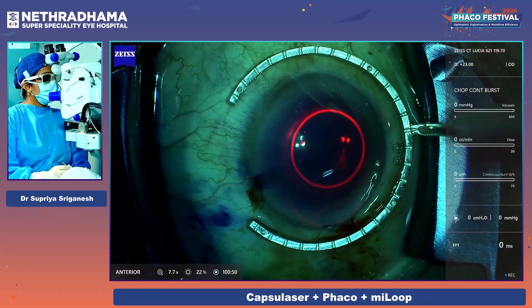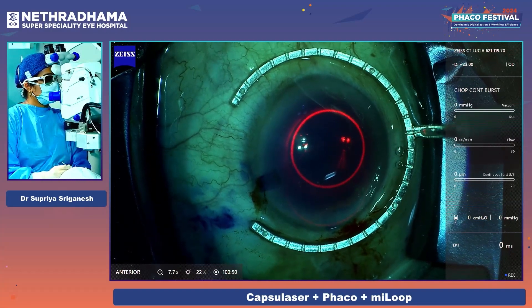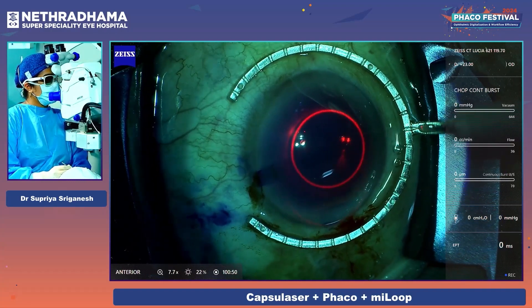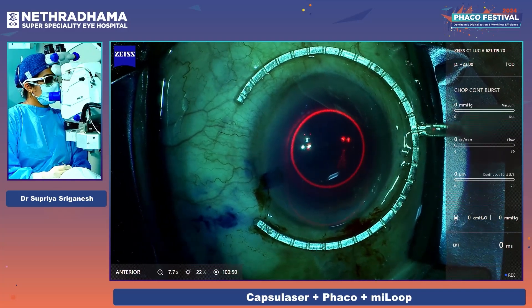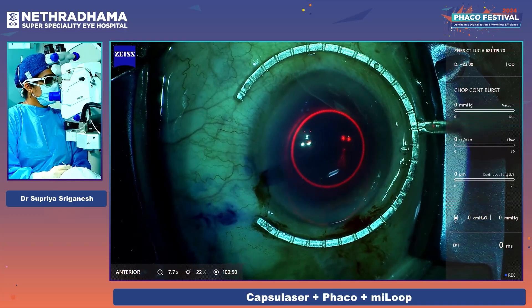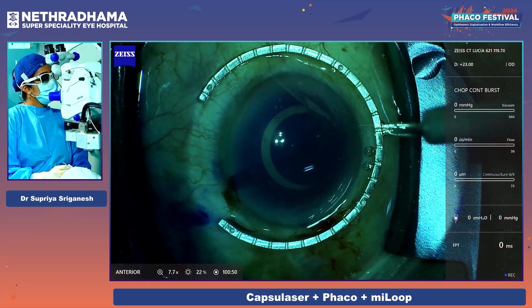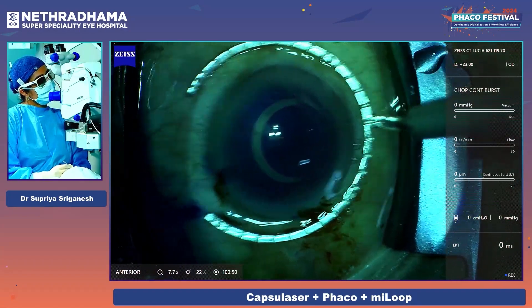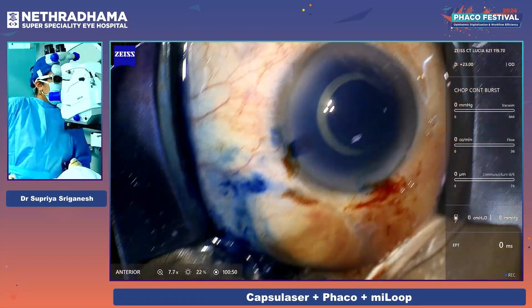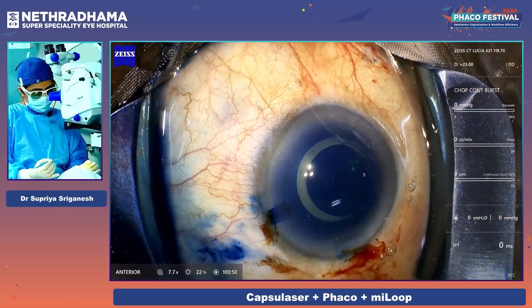Yes — two of the red dots are on the cornea, two of them are on the capsule. It's important to focus on the dots on the capsule. It just takes about one third of a second for this laser to fire — just observe. I'm stabilizing the eye now. You can see that the laser is fired. It's a little bit uneven there — I'm just going to use a forceps to complete the rhexis.